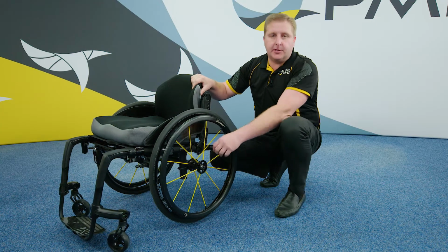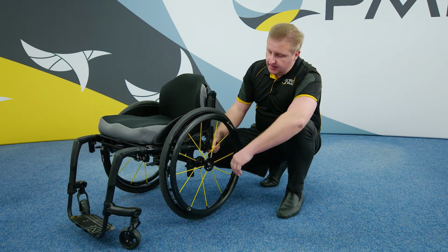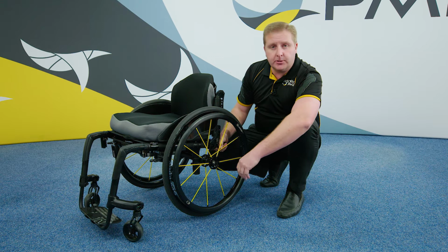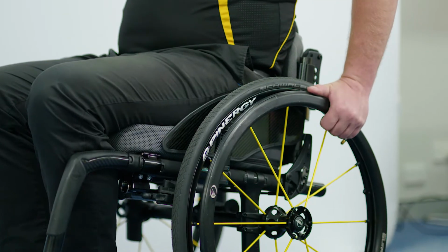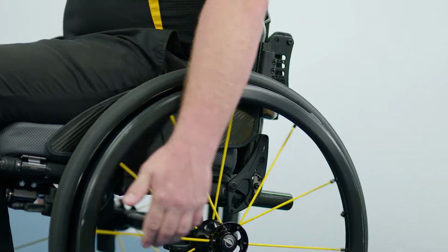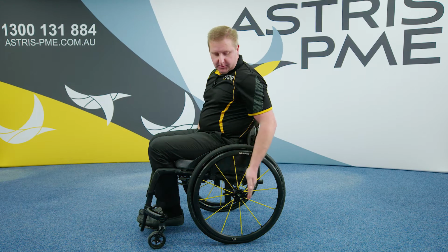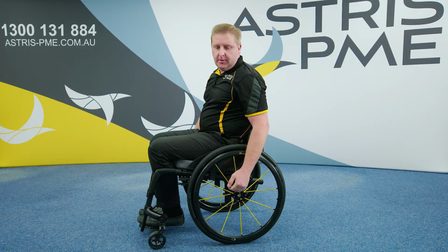The position of the axle on most wheelchairs is adjustable up and down. Some wheelchairs it's set, and that would happen in the scripting process. It's important to ask questions to your supplier as to whether your rear seat height can be adjusted. This enables the user to be able to reach the wheel in the correct and right position to get the optimum push on the wheelchair wheel. With your rear axle position, with your COG and your rear seat height, having this adjustable or setting up correctly is important.